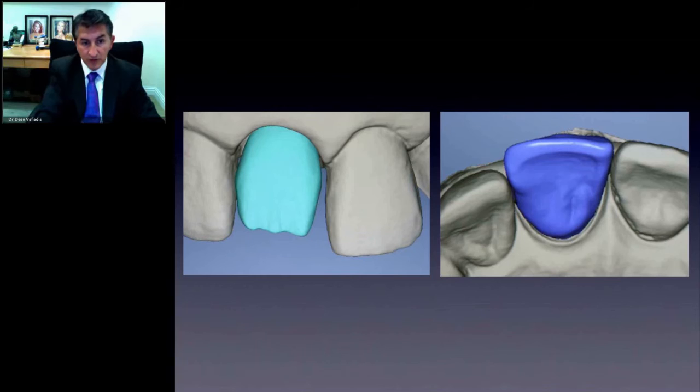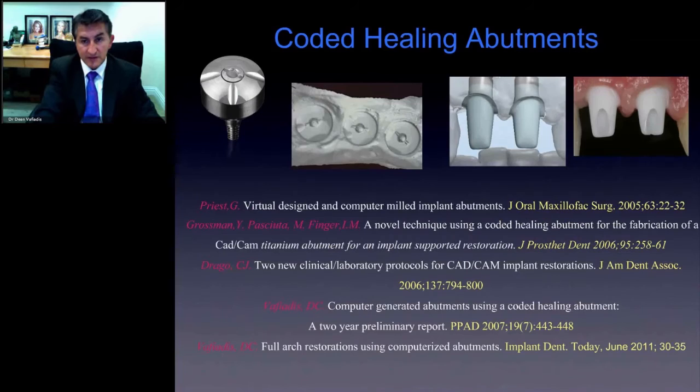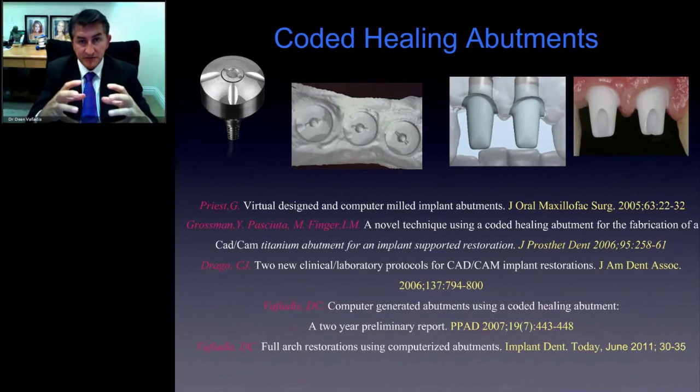We can also make copings. Our protocol now for 4 or 6 anteriors is making Emax copings and then picking them up and going right to finish. So it's really a great technique to be able to make these restorations. And again, the design for us is a lot faster and cleaner. When we combine those two technologies, we get into the implants and the anterior restorations and the posterior restorations, where we're combining the two types of digital software.